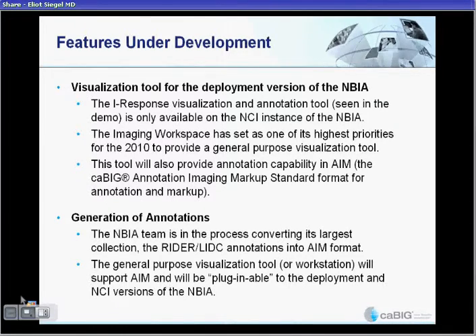Additional features under development include a visualization tool for all users of nbia. So we're in the process of trying to supplement the commercial version, which we have at NCI, with a free and open source visualization tool that we would be able to distribute to all users, so that you would be able to have the functionality of the visualization tool that I had demonstrated.